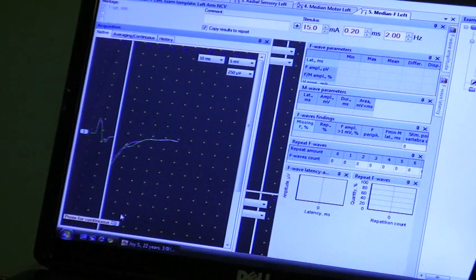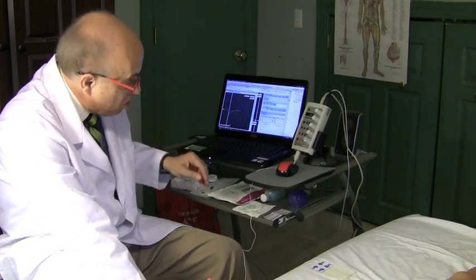Now with the F wave, it's very important to distract the subject while you're doing this because it might have some reflex responses in it. And when you distract them, you can get a better response. So let's try this.